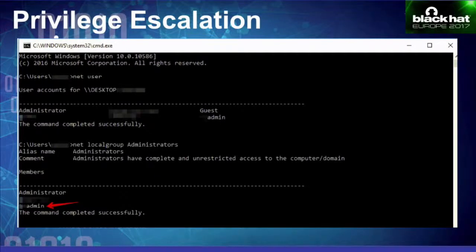After that, we installed the Windows Sysinternals utilities, including Procmon. Procmon allows you to monitor any process-related, thread-related, file activity-related, and registry-related activities.